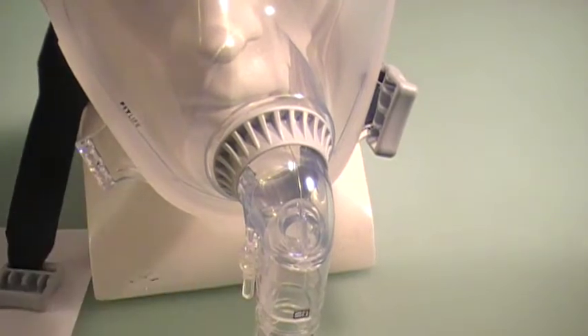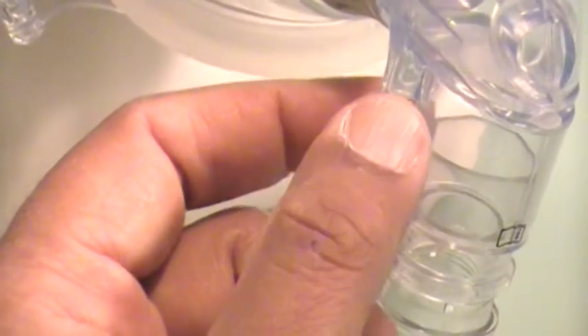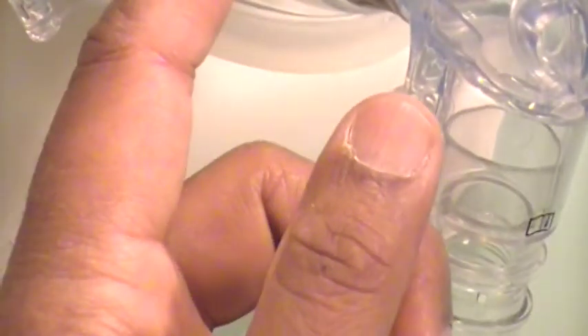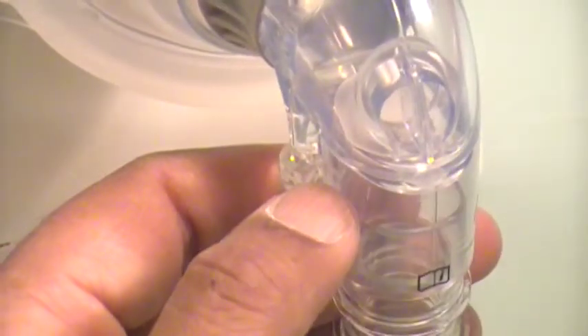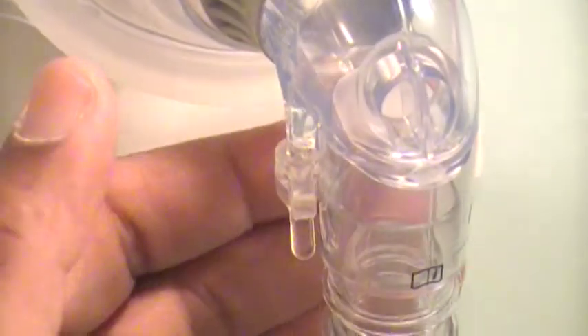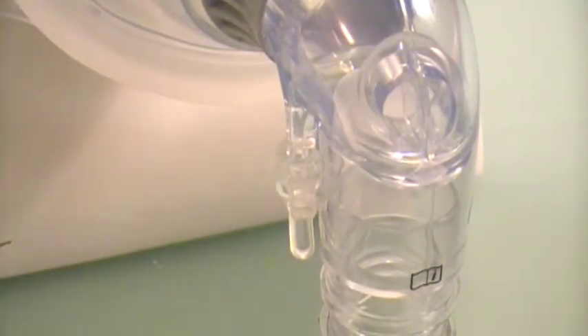At the bottom there is an O2 port where you can connect oxygen tubing. In hospitals, we also use it to measure the pressure inside the mask with a special tube. There is also a round opening which is the anti-asphyxia valve — meaning if you have a power failure, you will be able to breathe through here, but it will be very uncomfortable, and most people will feel it and end up pulling the mask off.